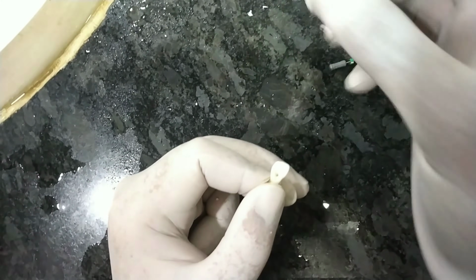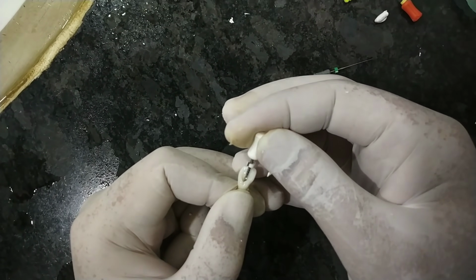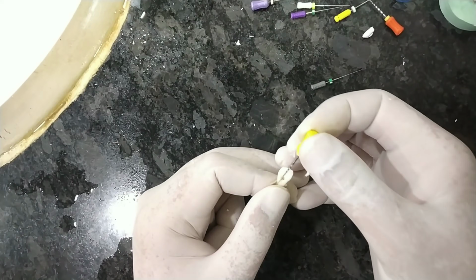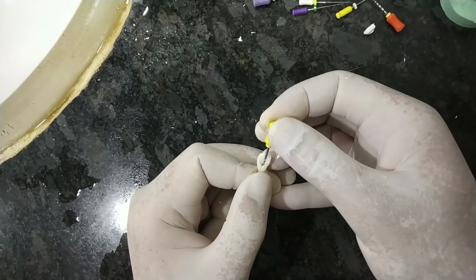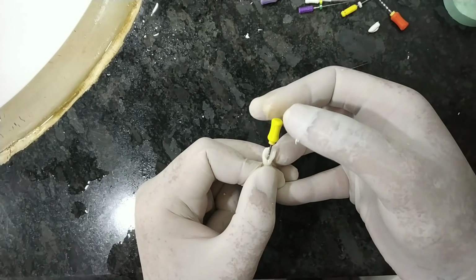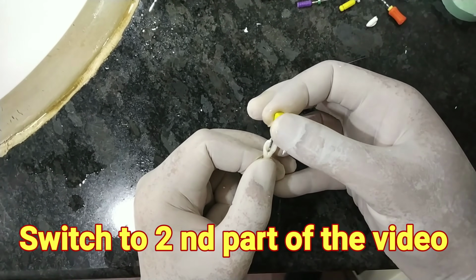Then again irrigate. Then use the S2, shaping 2 file, 3/4 motion, then we are using the finishing file. So this finishing file is the F1 file. You can enlarge till the F1 or the F2, which is the red color file.